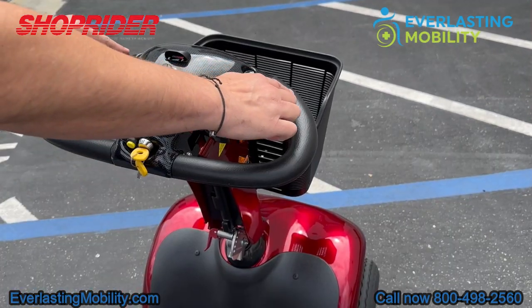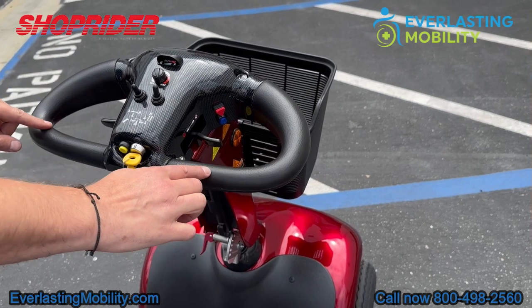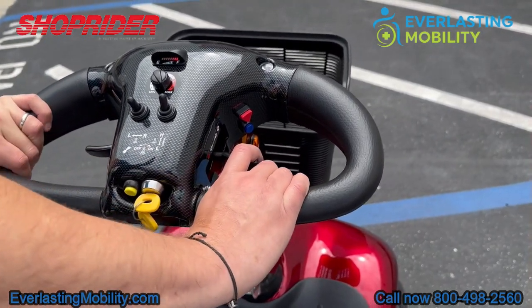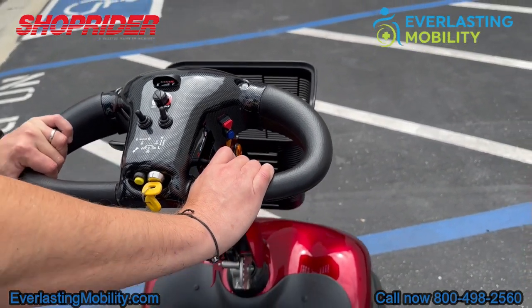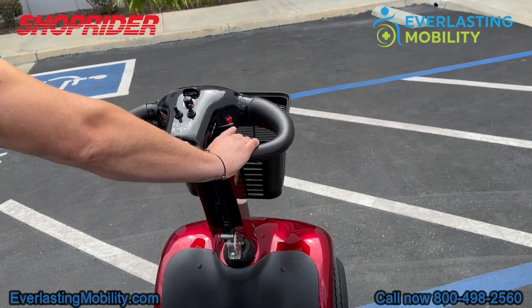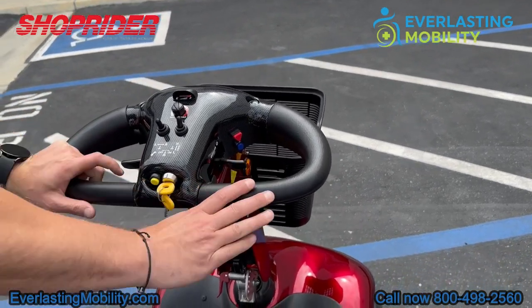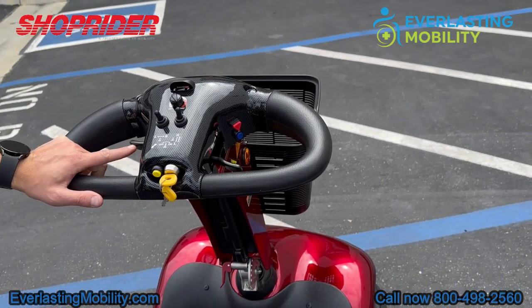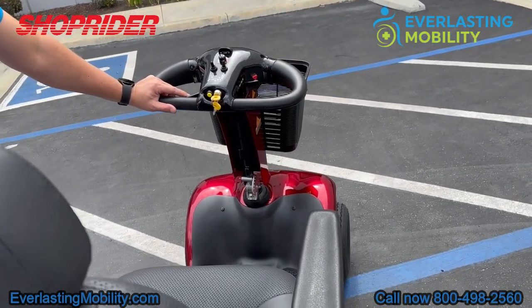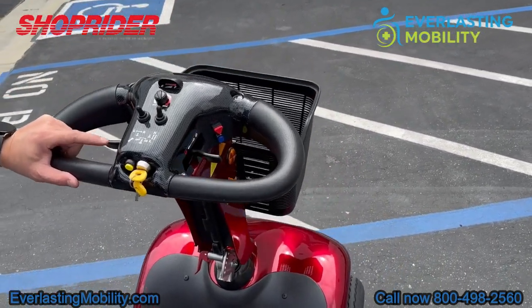The tiller on the Enduro is a delta tiller, which is great for people with limited dexterity in their hands. You rest your wrists on the crossbar closest to you on the tiller and use your thumbs to accelerate forward or backwards. It is an ambidextrous throttle, so you can actually accelerate forward or in reverse with just one hand, which is a great feature.